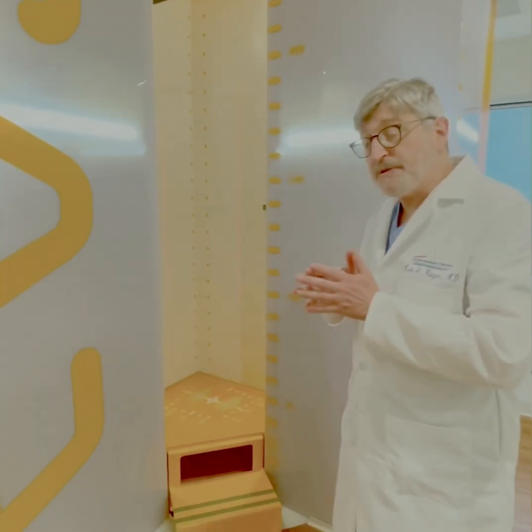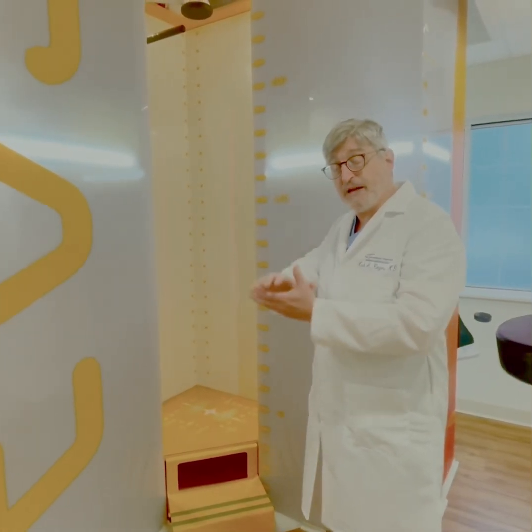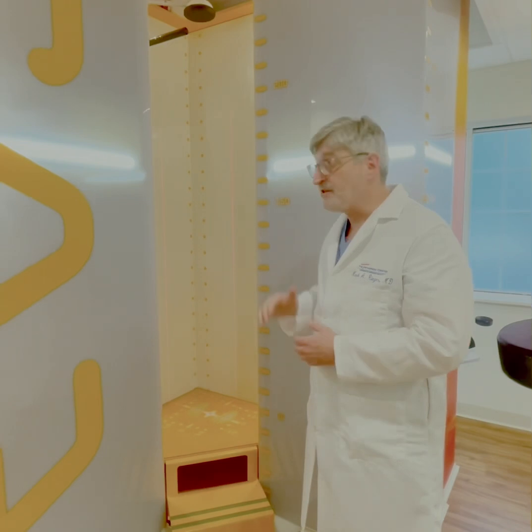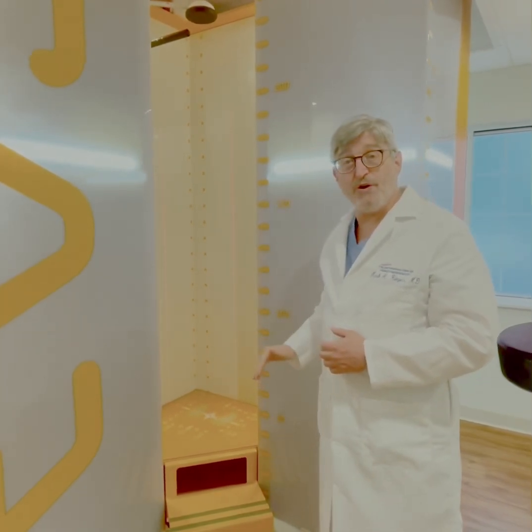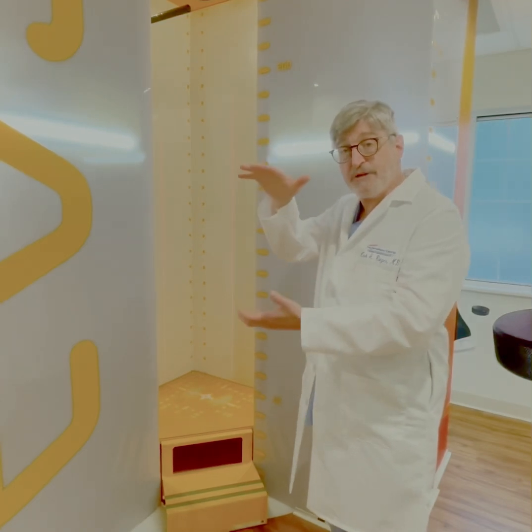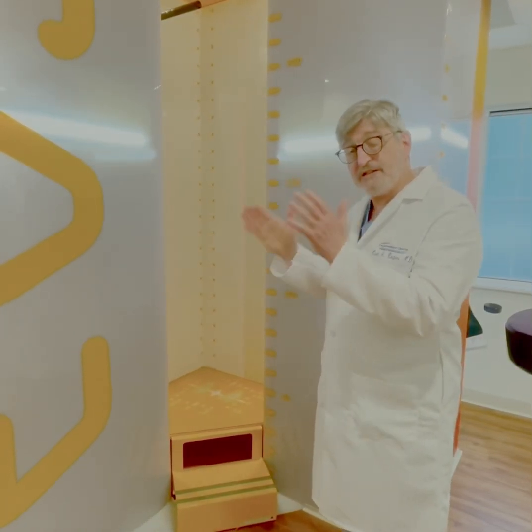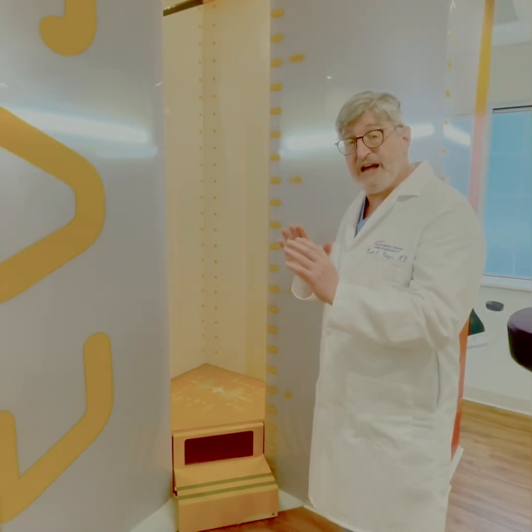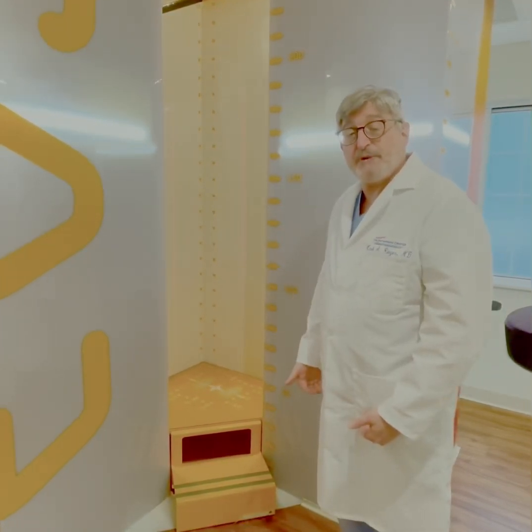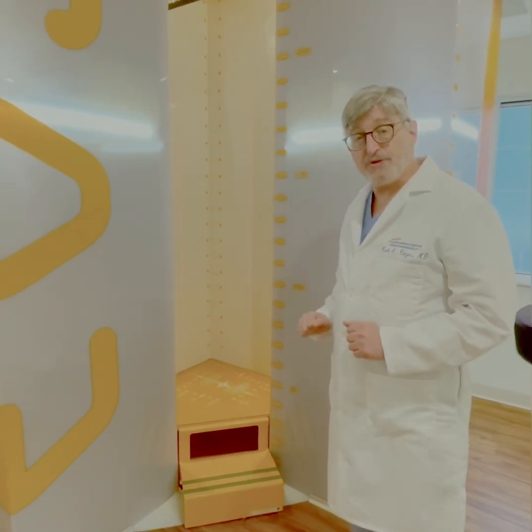And because they're able to magnify the amount of radiation, so you can use a small amount of radiation but get a larger effect of the radiation, you're able to scan from the head to the toe without distortion, without stitching things, meaning taking different pictures and trying to put them together. It's one uniform picture, so we can actually see the spine in the front view and the side view, and also get limb lengths because sometimes the lower extremities can contribute to the scoliosis.